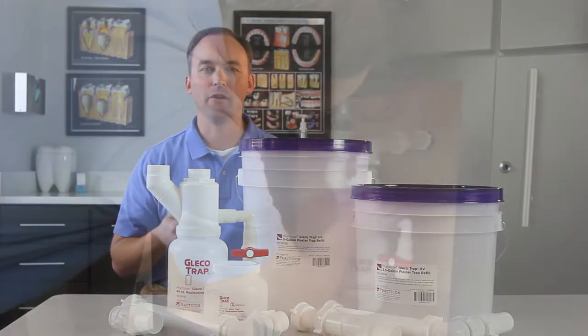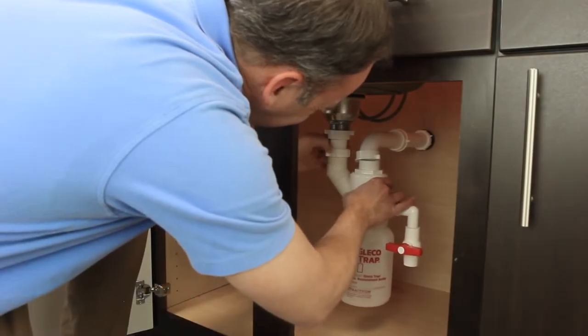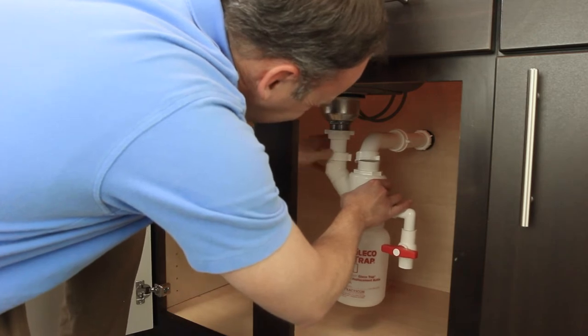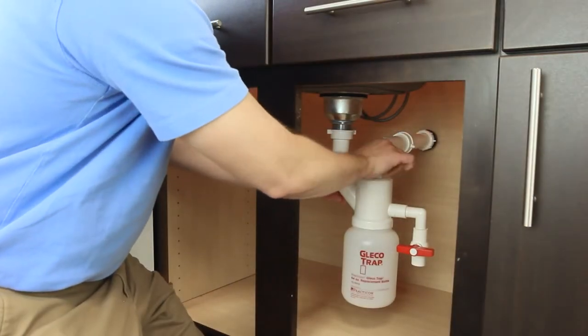First, disconnect and remove your current sink trap. Next, connect the sink drain to the 45 going into the GlecoTrap, and connect the wall drain to the top of the GlecoTrap.